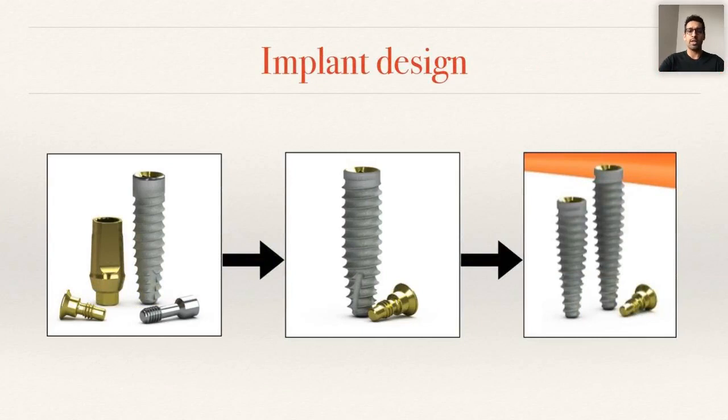Now, let's have a look at these three implants from BioHorizons, and there's really been an evolution in the design since I've started doing full arch and pterygoid implants, and that's really due to design changes by BioHorizons. On the far left, we've got a 3.8 diameter implant, and it comes with a 3-in-1 abutment. That's one of the huge benefits of using the BioHorizons implants. They come with a carrier. And it's really crucial to be using an implant with a carrier, because when we go into the complications, you'll understand why.